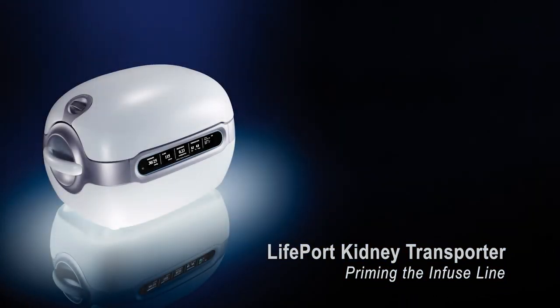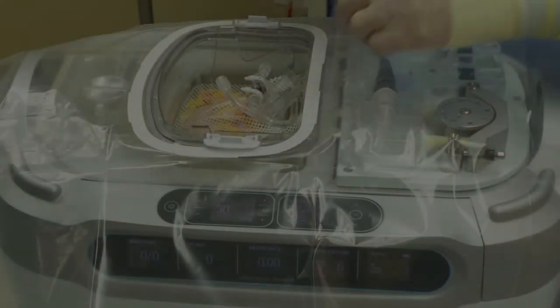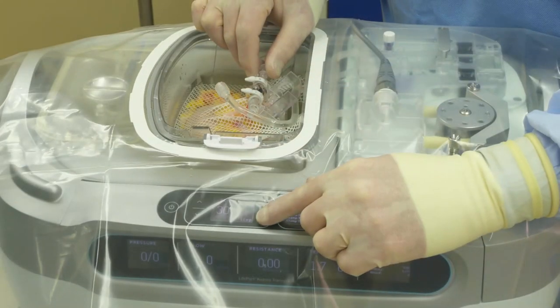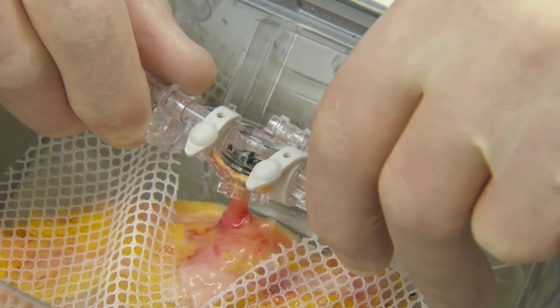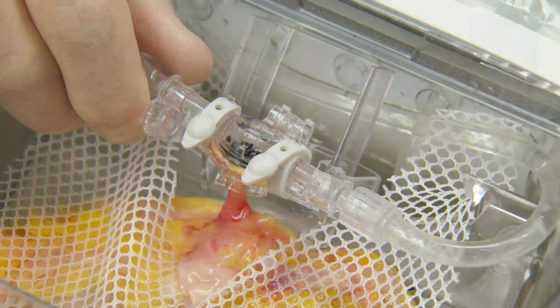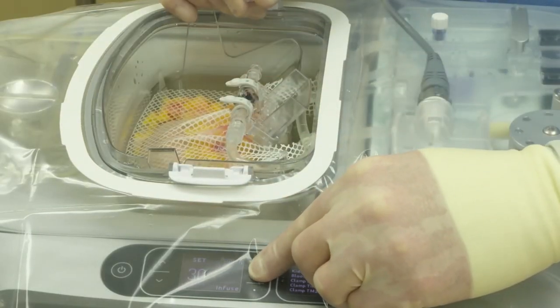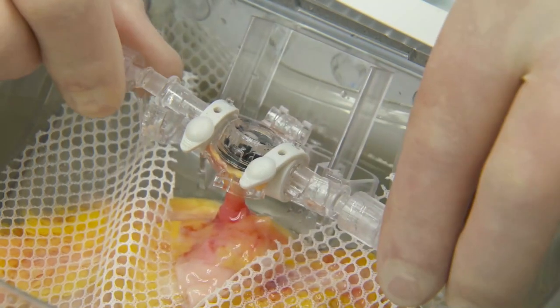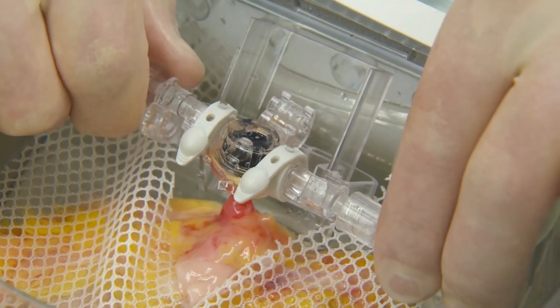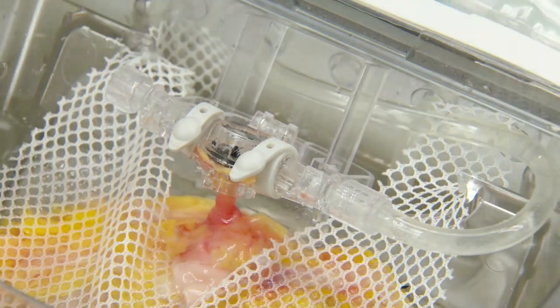Priming the infuse line. Press stop to stop the wash mode. Then connect the infuse line to the opened end of the cannula and tighten the luer lock fitting. With the end cap removed from the opposite end of the cannula, press prime mode. Clear the bubbles from the infuse line and the cannula, then replace the end cap. This should cause the pump to stop and beep.